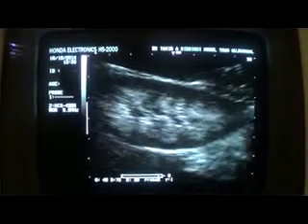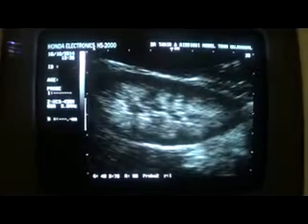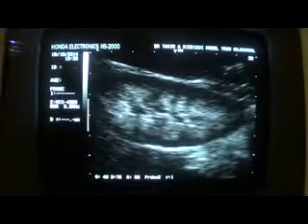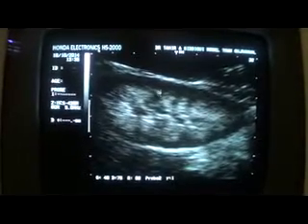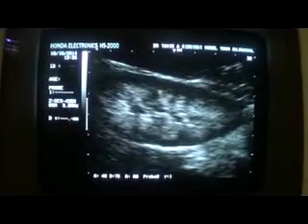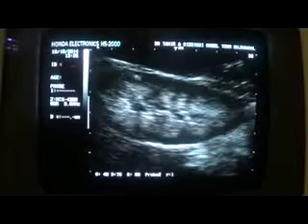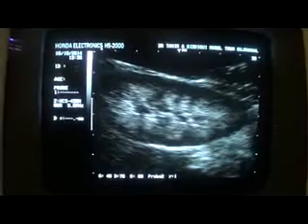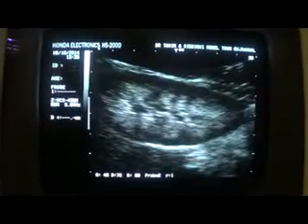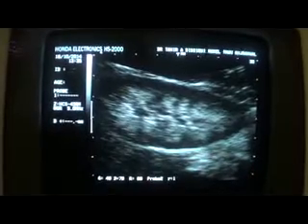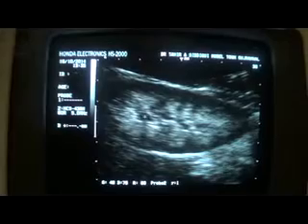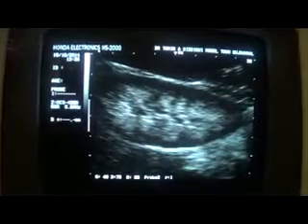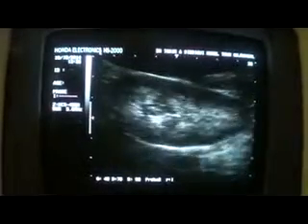Here you see there are multiple focal echogenic areas scattered throughout the renal parenchyma, mainly in the medullary region rather than the cortex. This is the cortex of the kidney, and this is the medullary region where you see these globular areas. Another thing to note is there is minimal dilation — very minimal dilation of the collecting system — and the central sinus echogenic complex is muffled. This is the right kidney.